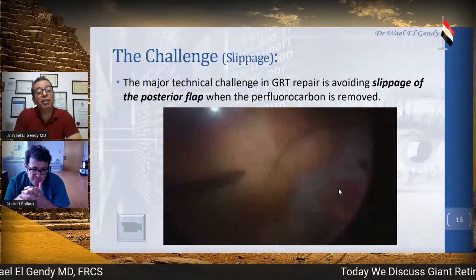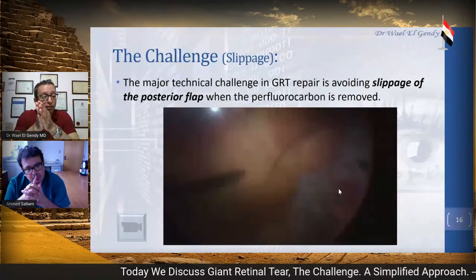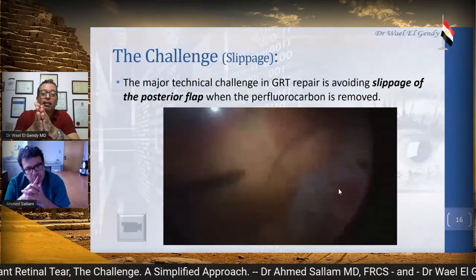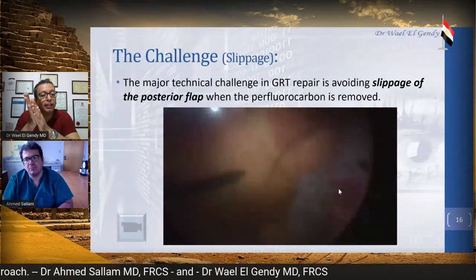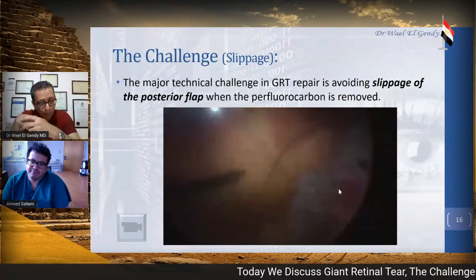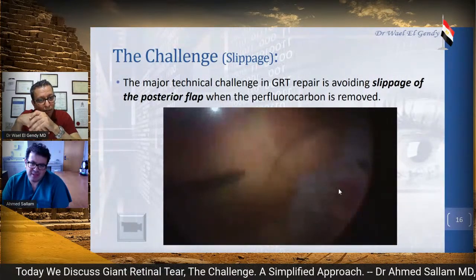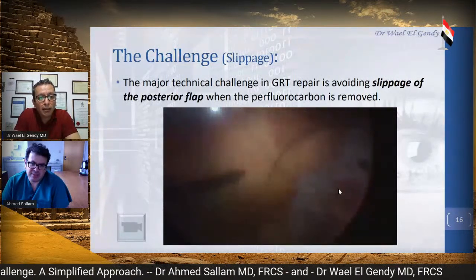Okay, if you decide to leave it, now we have a problem that we did our laser, and then our laser marks in the retina are separated from the laser marks in the choroid and the retinal pigment epithelium. Do you do laser again? That's a good point. I probably would not. You wouldn't do laser again, not even online? I probably just leave it like this.